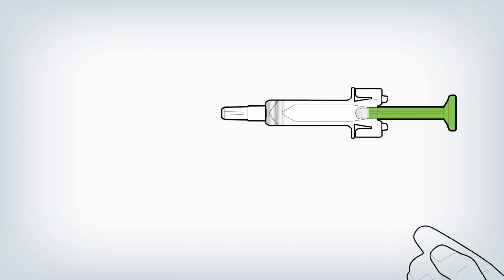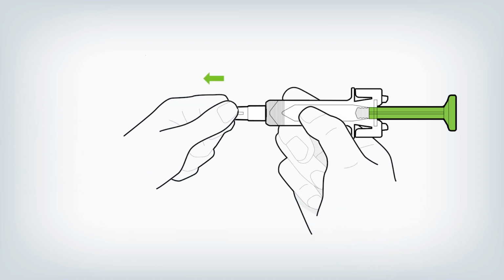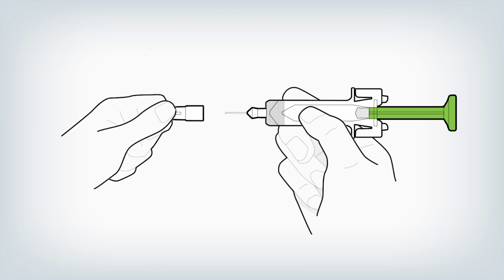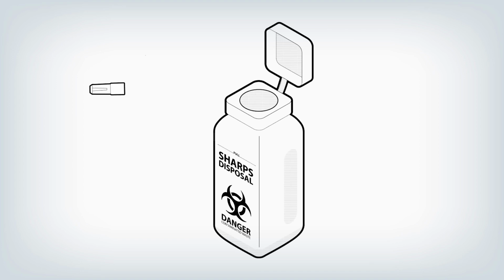Hold the needle shield firmly by the middle part of the syringe with one hand, then pull off the needle cap with the other hand. Do not hold the syringe by the green plunger while removing the needle cap, as you may accidentally pull out the plunger and waste the medicine. Throw away the needle cap in a sharps container. Never reattach the needle cap after removal, as this may cause accidental needle stick injuries and will damage the needle.